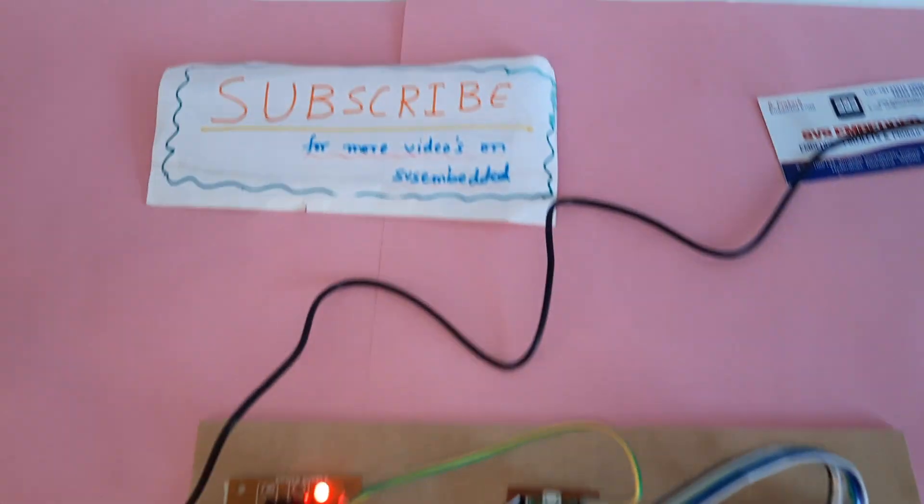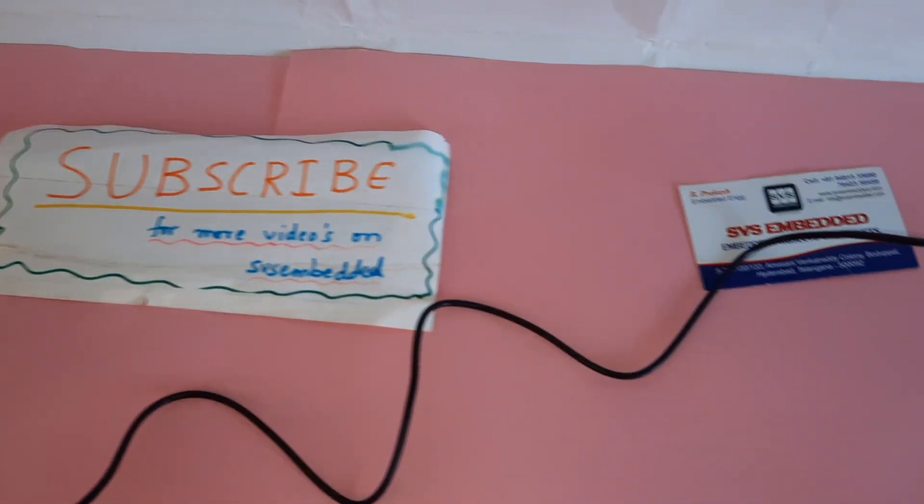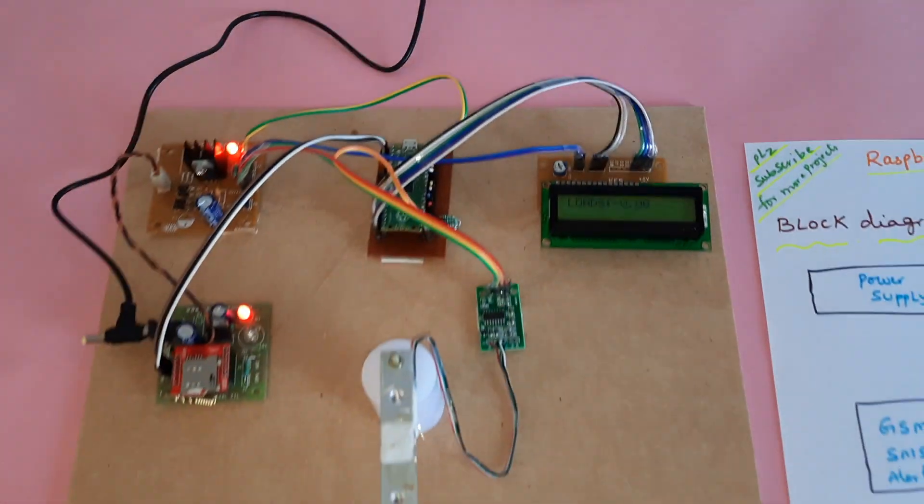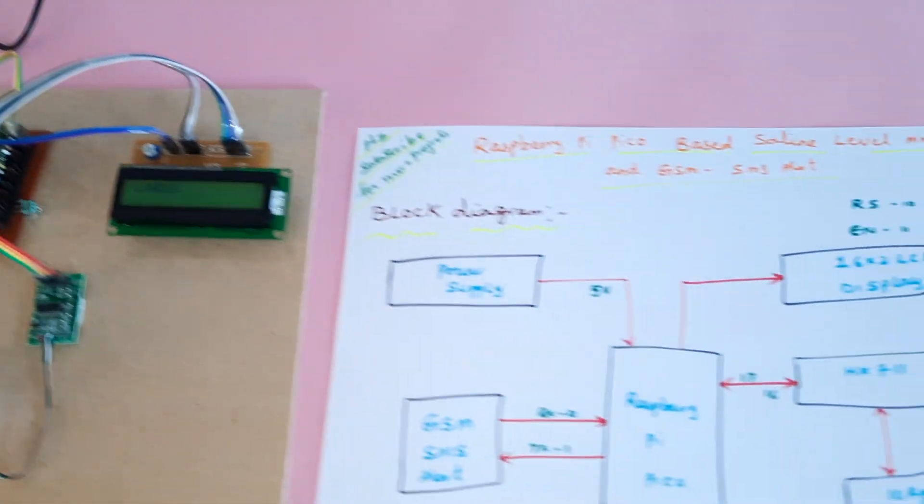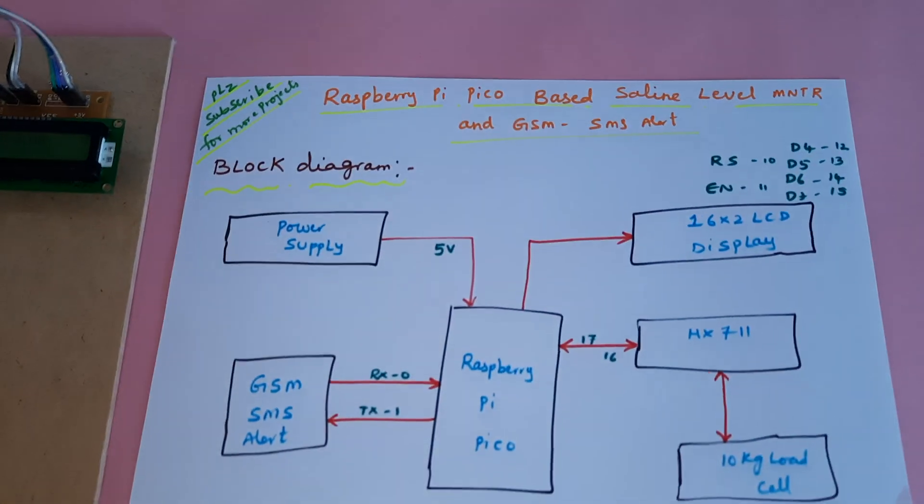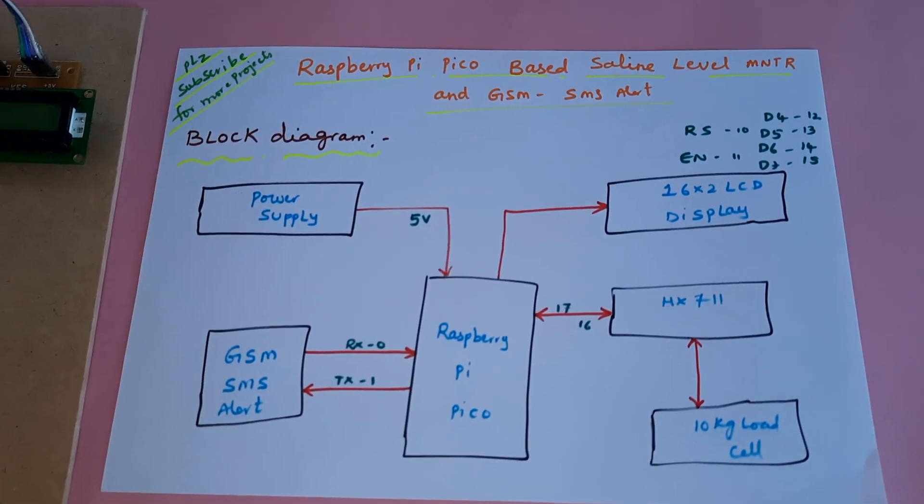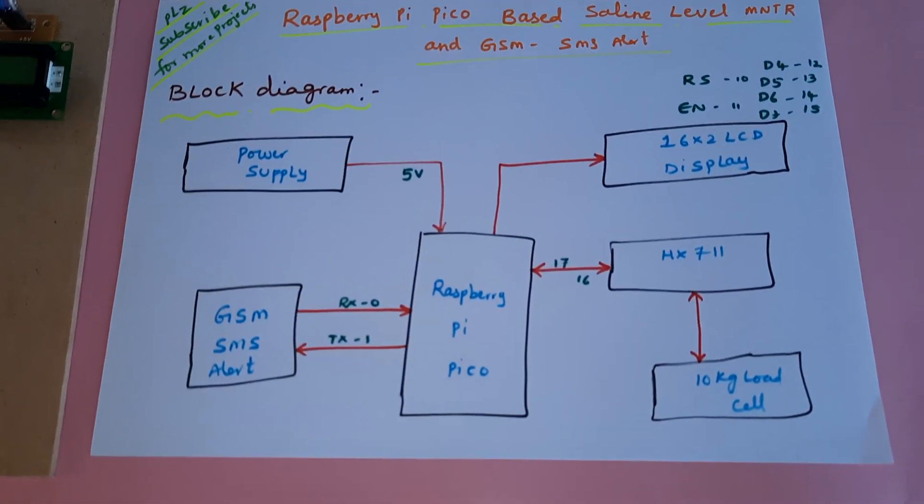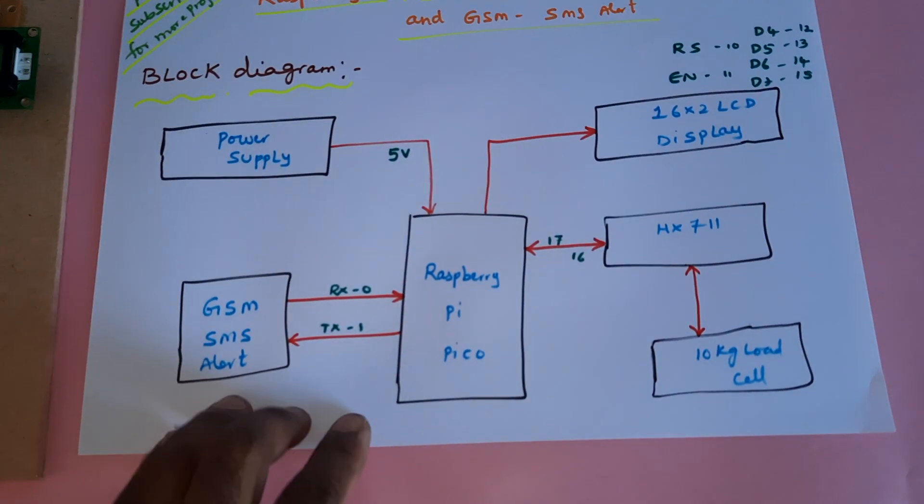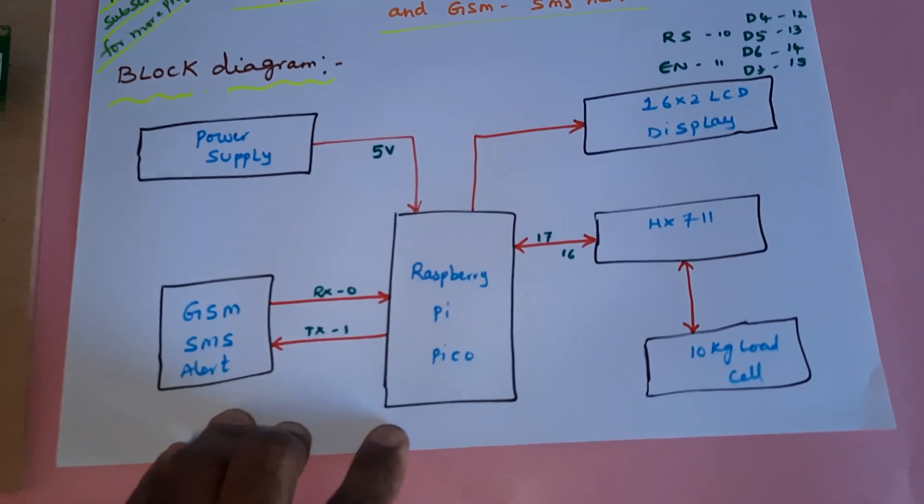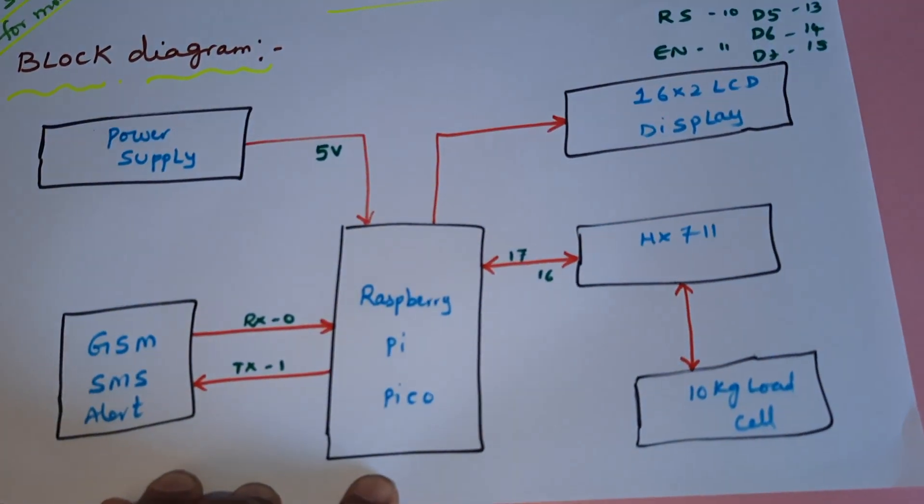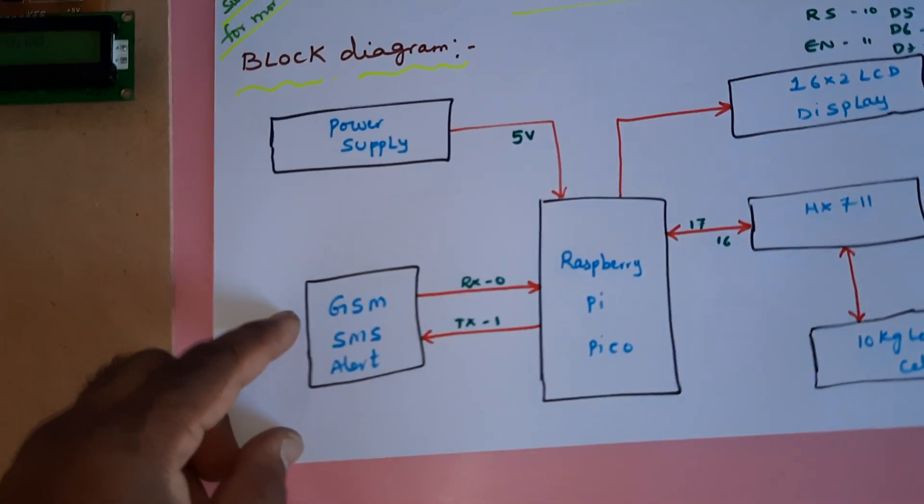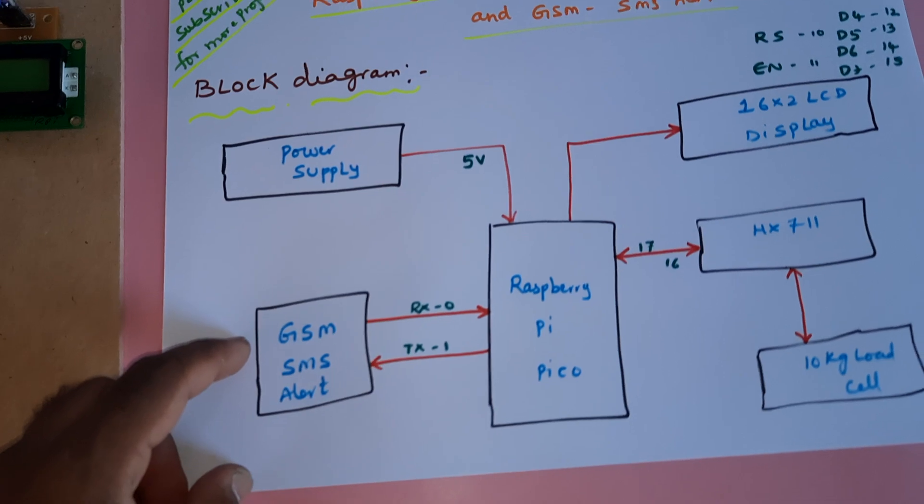Hi, we are from SVS Embedded. The project title is Raspberry Pi Pico-based Saline Level Monitor and SMS Alert. In this project, we are using a Raspberry Pi Pico, GSM SIM800L module, and power supply module.